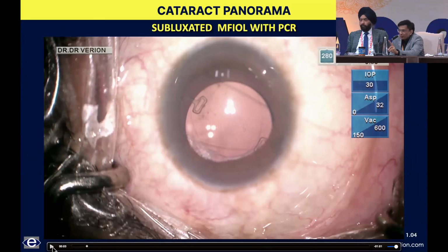The advantage in the glued IOL is, these are multifocal IOLs. So when you tuck, untuck, you can keep on tucking, untucking till you know you're bang centered on the Purkinje image, bang on track. So that's one big advantage of it. My preference in such cases, and I've done a lot of such cases with glued IOL, multifocal glued IOL, you can create with a very good result.